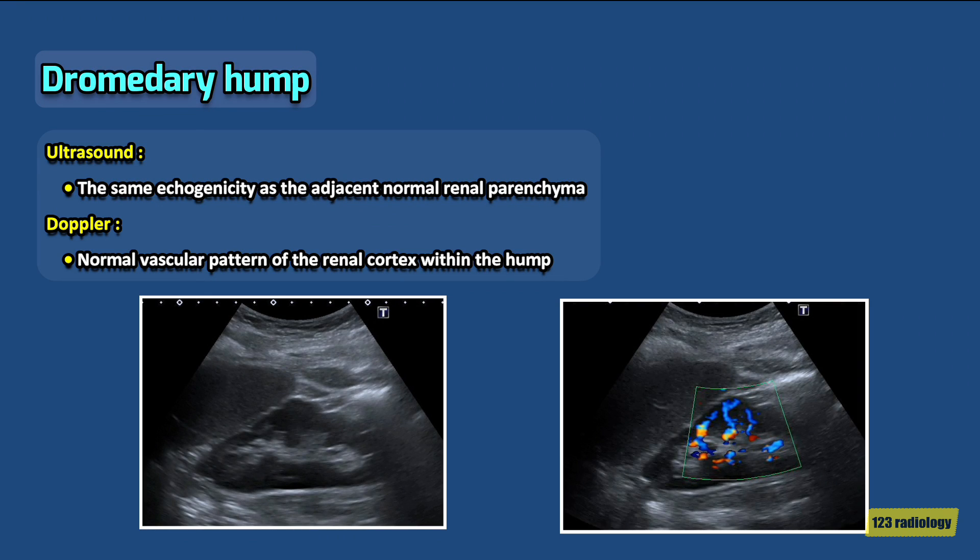On ultrasound, the dromedary hump shows the same echogenicity as the adjacent normal renal parenchyma, while a renal tumor may appear as a heterogeneous mass with areas of cystic changes and hemorrhage. On color Doppler ultrasound, it demonstrates a normal vascular pattern of the renal cortex within the hump.